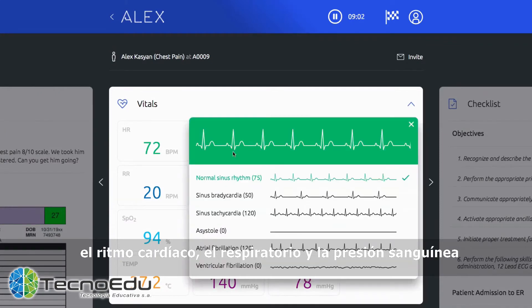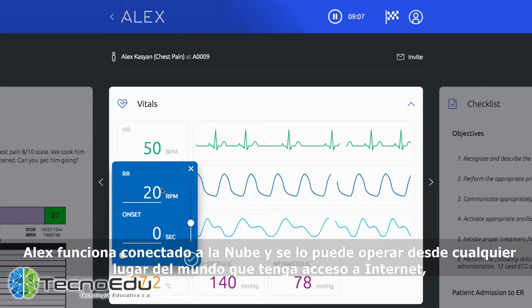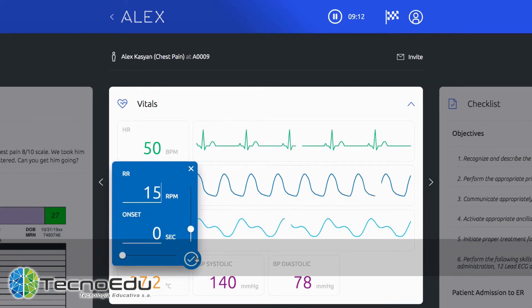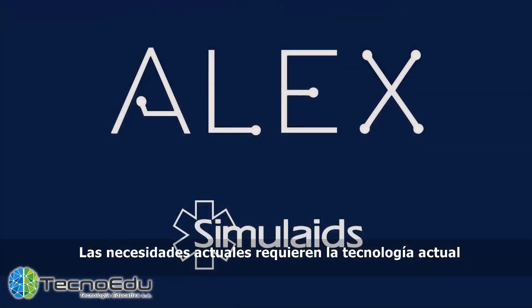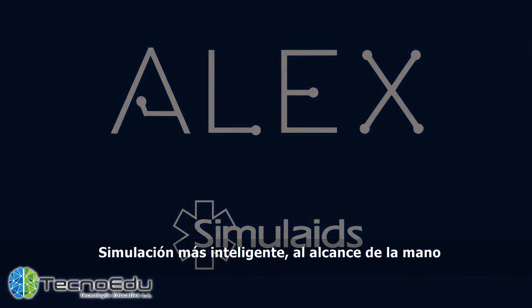Alex is cloud-connected and can be operated from anywhere with any internet device, with no special plugins, apps, or licenses. Today's needs require today's technology — smarter simulation within reach.